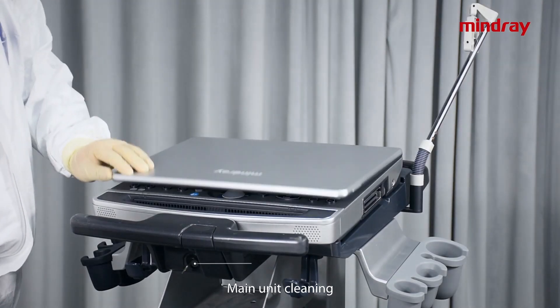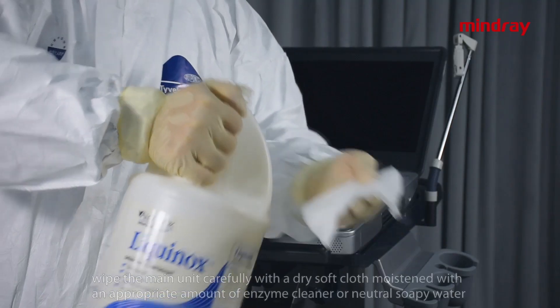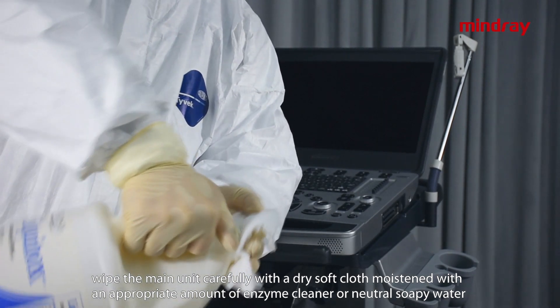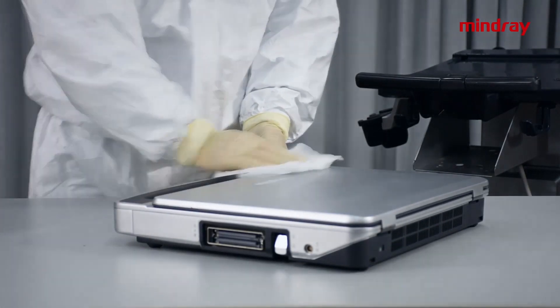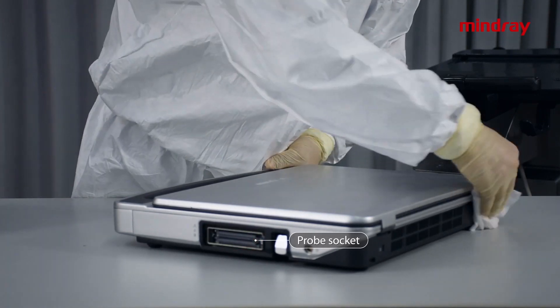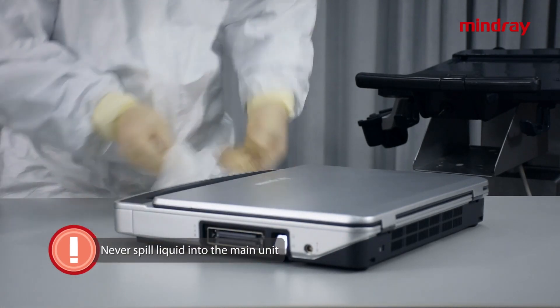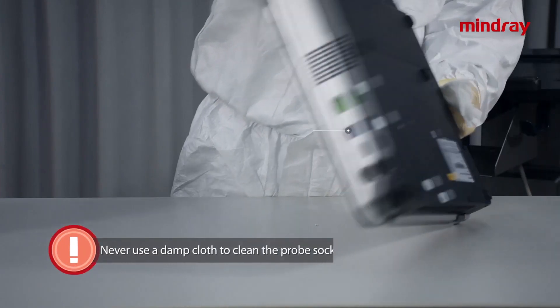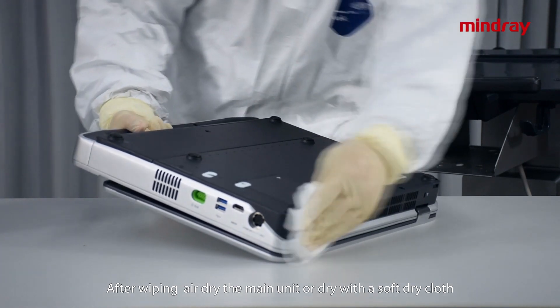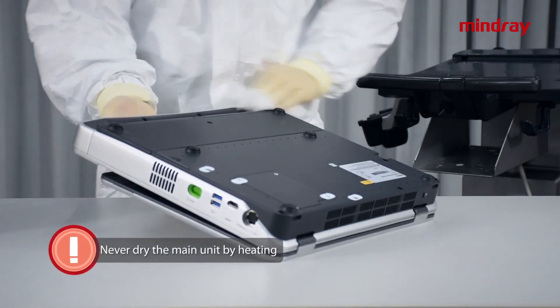Main unit cleaning: remove the M9 main unit from the trolley. Wipe the main unit carefully with a soft dry cloth moistened with an appropriate amount of enzyme cleaner or neutral soapy water to remove dust and stubborn stains. Caution: never spill liquid into the main unit. Never use a damp cloth to clean the probe sockets and I/O interfaces. After wiping, air dry the main unit or dry with a soft dry cloth. Never dry the main unit by heating.